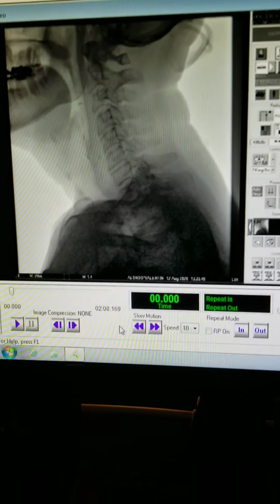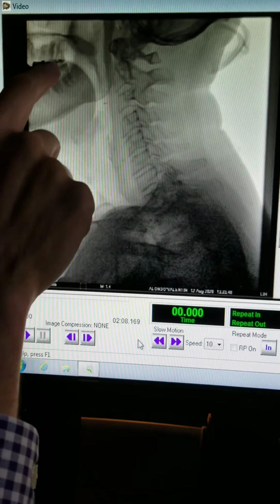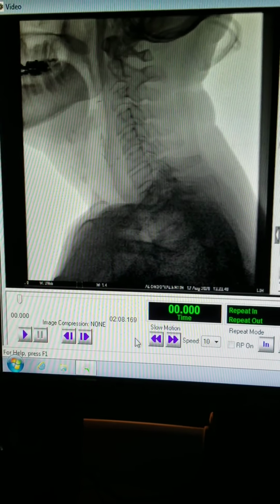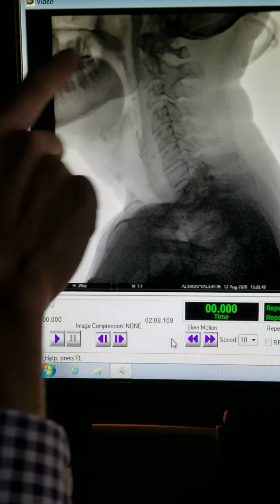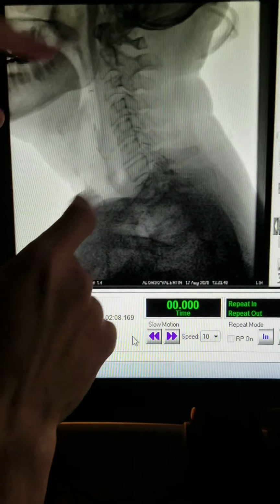This is your spine, the cervical portion at least. We're missing some of the front views of your mouth, but this is the back of your jaw. Your teeth are here. The darker areas are any dental work that you've had. So two primary things that we're looking at when you swallow are here. The liquids and solids come in here. They're going to get transferred to this section here, which is the throat phase.